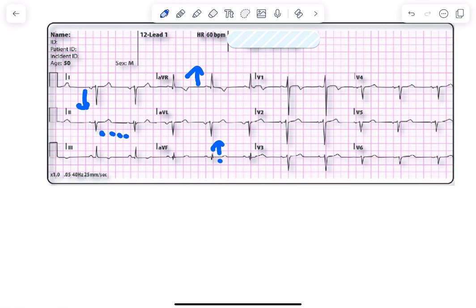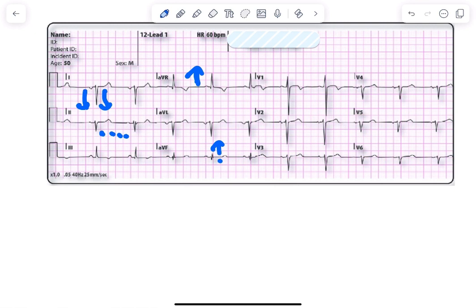Look at the aVR. What happened to the QRS complex in aVR? It's predominantly upward and in lead I it is predominantly downward. This is suggestive of global negativity. QRS is negative in lead I and positive in aVR, global negativity.